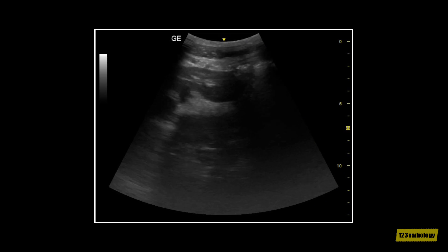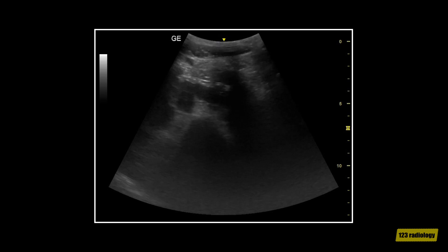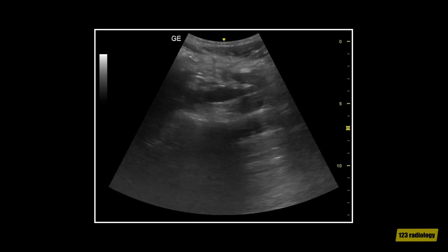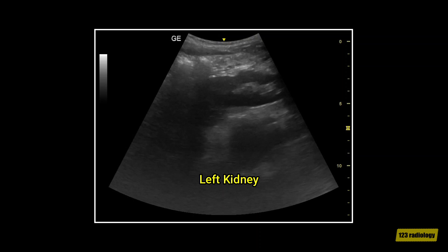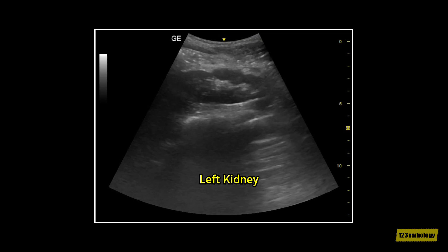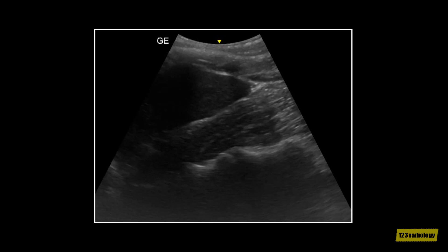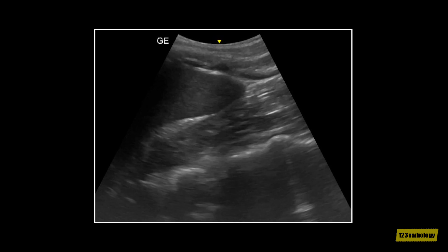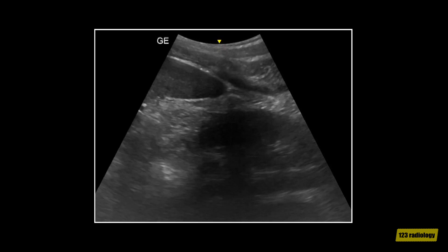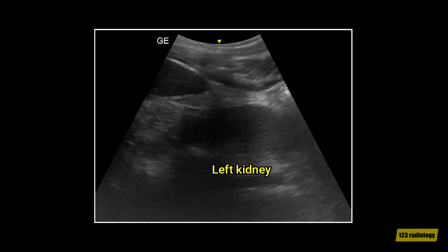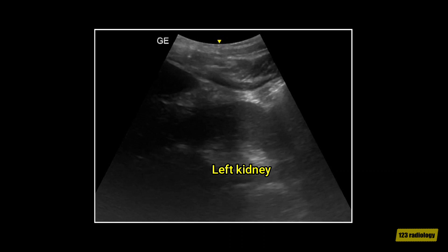As we continue, we can see the left kidney. This is a longitudinal view of the left upper quadrant of the same patient. It shows that the left kidney lies in a lower position than the normal kidney.